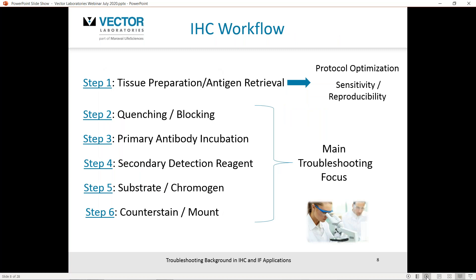Let's pivot towards the immunohistochemistry workflow — it is a series of sequential incubation steps, steps one through six, outlined here simply. Step one, tissue prep, which covers fixation and antigen retrieval methodologies, is more associated with protocol optimization. I haven't seen a direct line between these facets and background development for immunohistochemistry. This step is mostly associated with sensitivity and reproducibility. My recommendation for the main troubleshooting areas would be steps two through six.